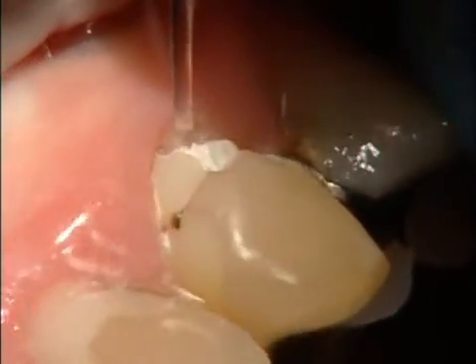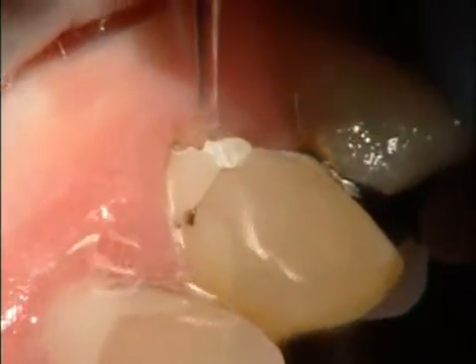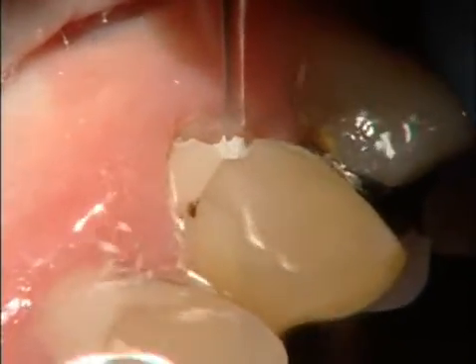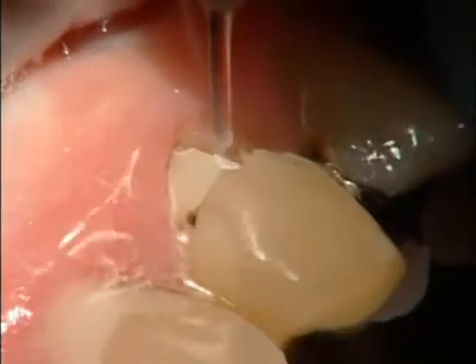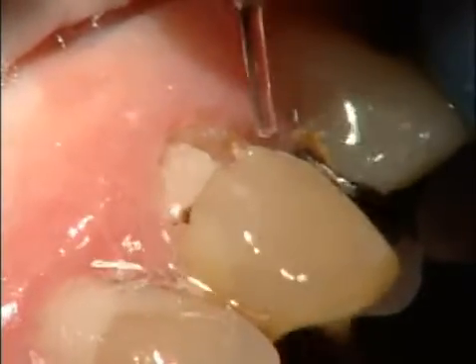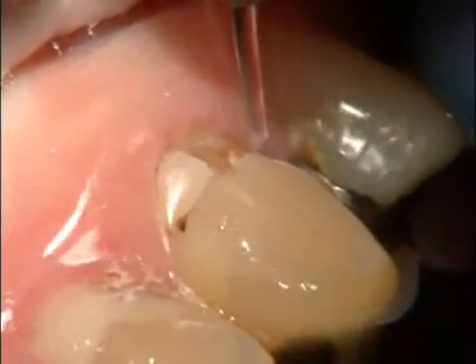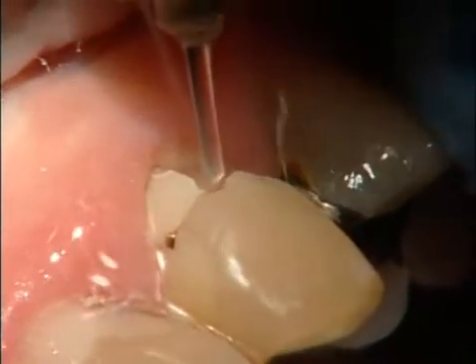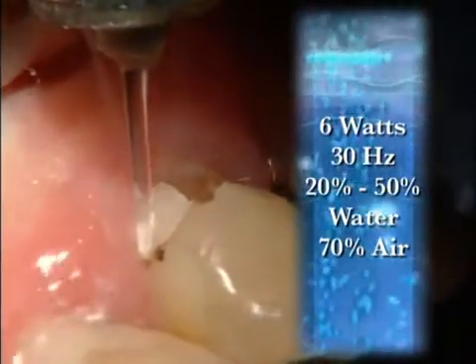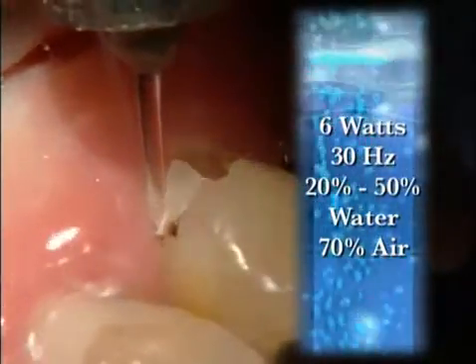So obviously, as long as you stay parallel to an existing metallic structure such as an old crown or an amalgam, there's little chance of doing damage to your laser tip. And I would start this at 6 watts with 30 hertz with 20 to 50% water and 70% air.